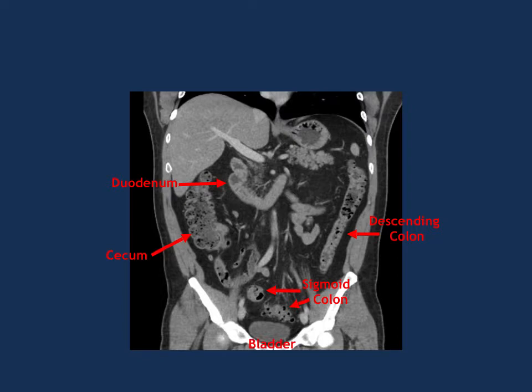Okay, great. And lastly, there's a fluid-filled circular sac known as the bladder. Yep, all the way down at the bottom, sitting right on top of your pubic bone and pubic tubercle. You can see the bladder.